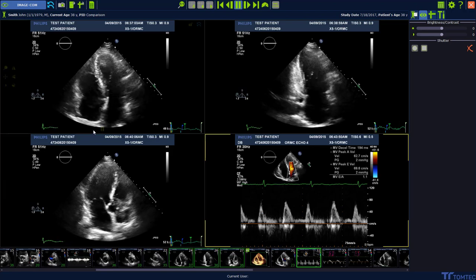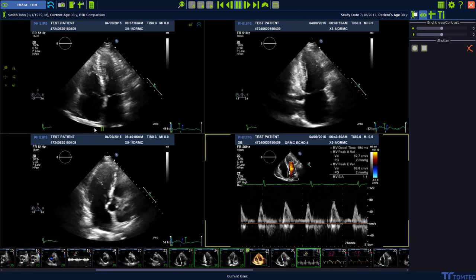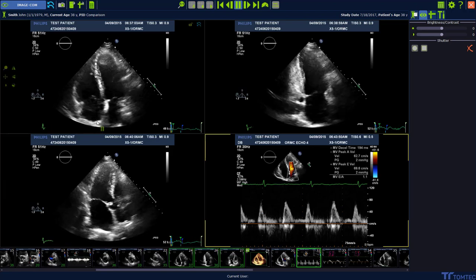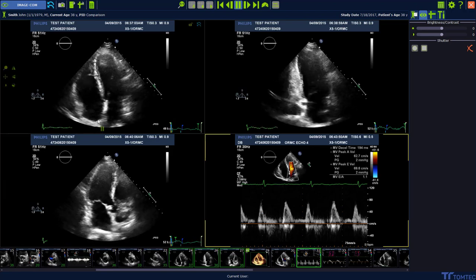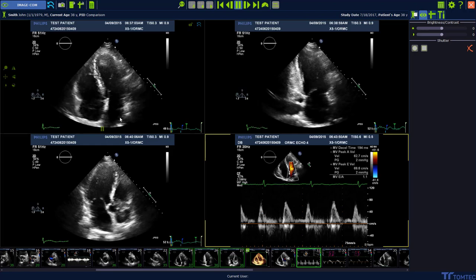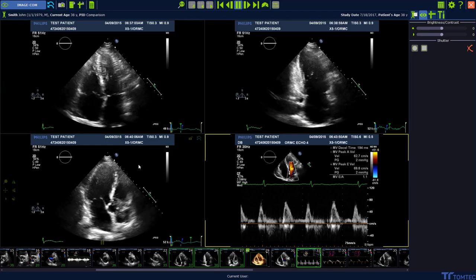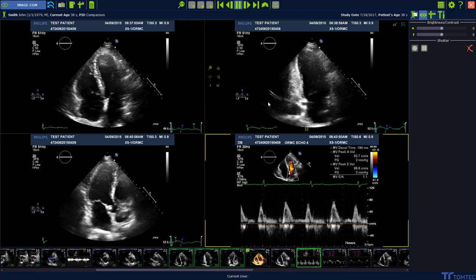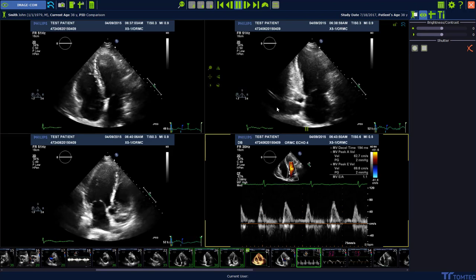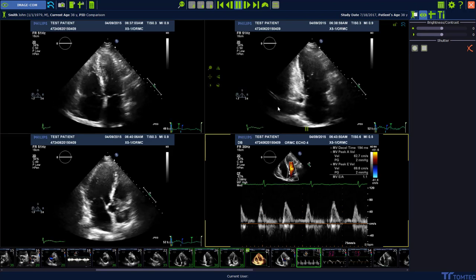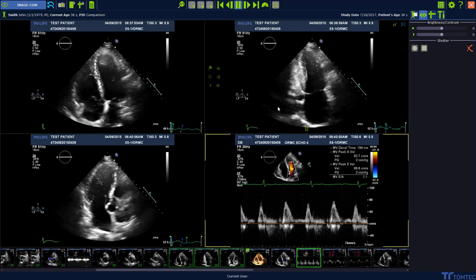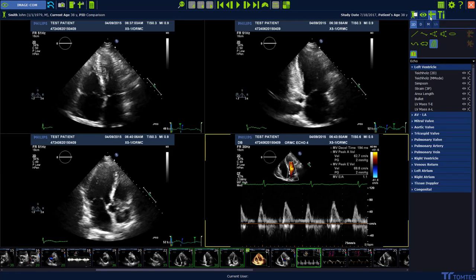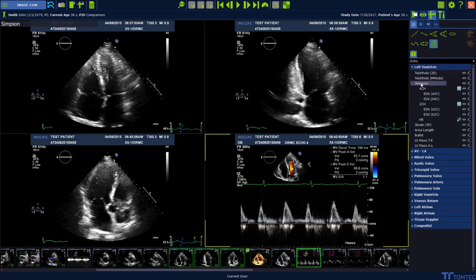Today I want to show you how to perform a quick automated Simpson biplane analysis with our AutoLV software. We start from Image-Com and we need an apical 4-chamber view and an apical 2-chamber view. To start the analysis, please open the measurements package and the left ventricle, and there the Simpson package.